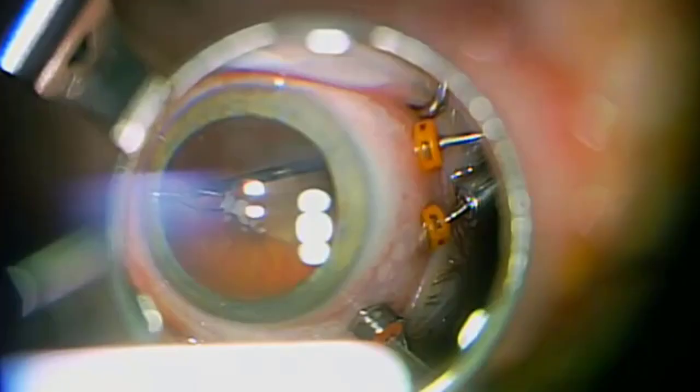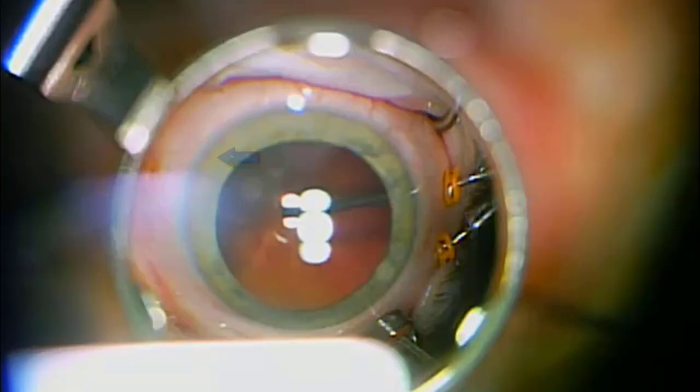A small piece from the posterior hyaloid was removed through the cannula and was placed on a Weck-Cel, and the surface that has the sample was marked with a sterile marking pen.